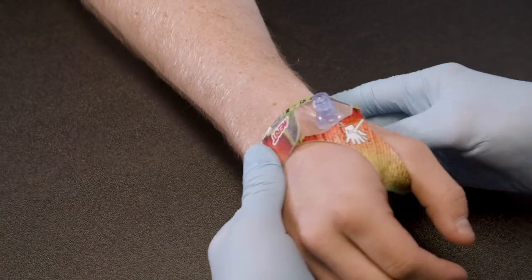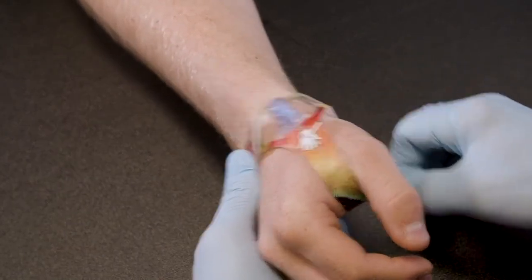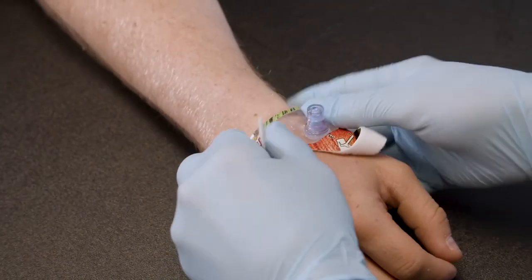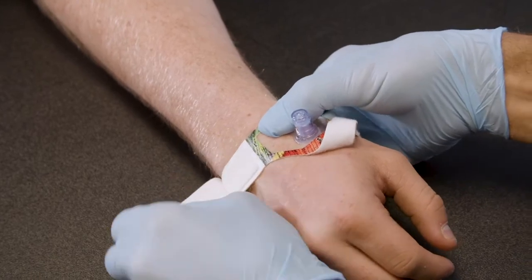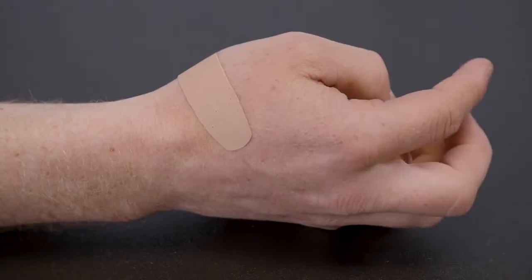If bleeding is present, inject air until bleeding stops and patent hemostasis is achieved. Wait a sufficient amount of time and repeat the device deflation and removal instructions. Once the air is removed and hemostasis is confirmed, carefully remove the Prelude Distal Sync and place a sterile dressing over the site per hospital protocol.